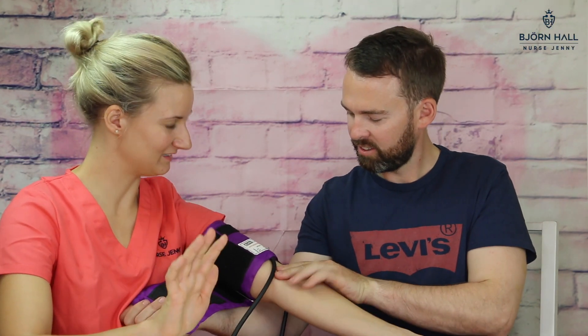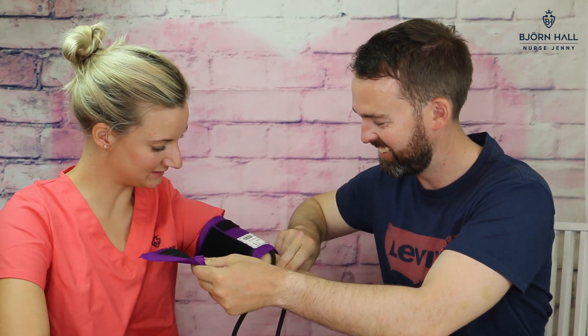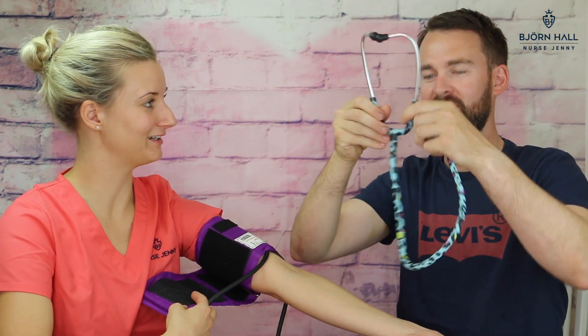My husband, who is a non-medical person, is now going to try and take my blood pressure. He's a little bit nervous. I can tell. I know what I'm doing. Okay, so remember what we said — find the brachial artery. Can you feel it? No. I have no heart.